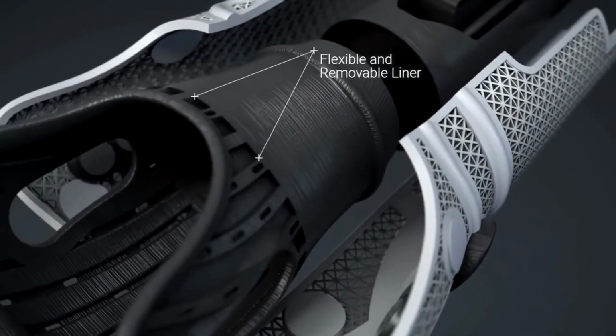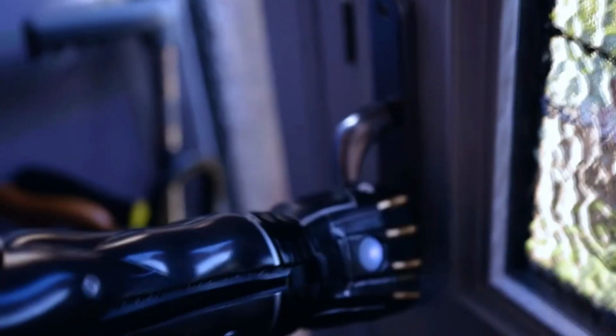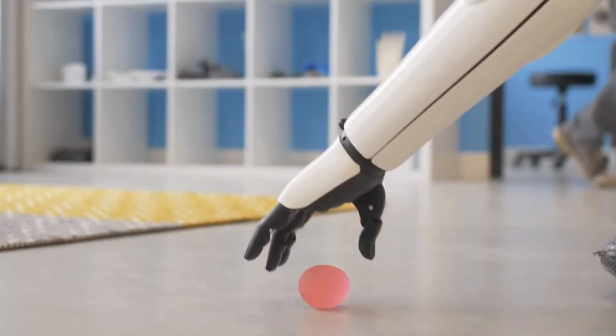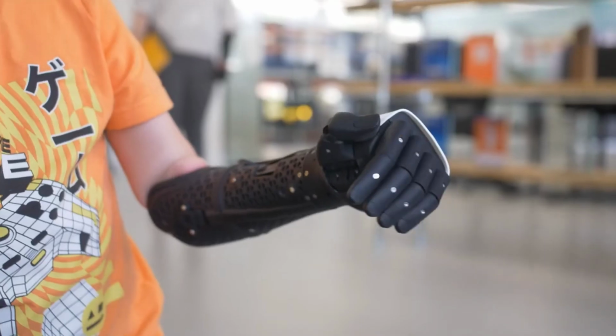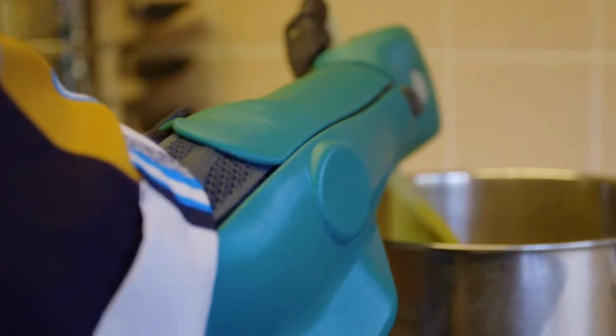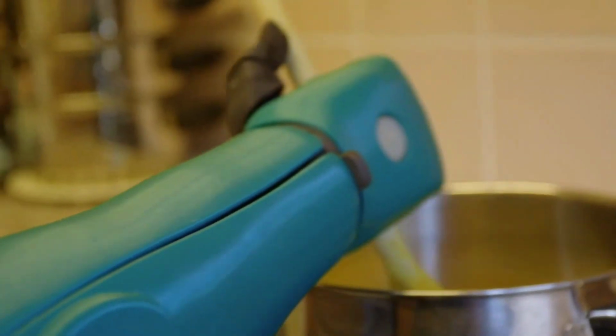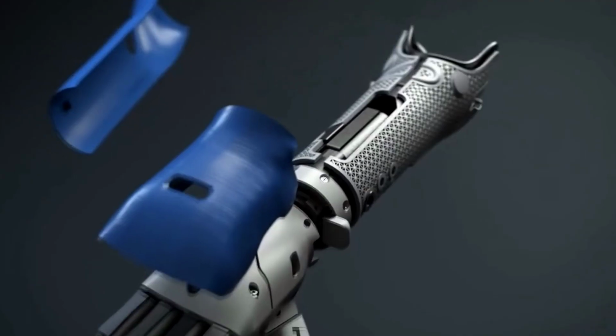With the use of this technology, amputees can now change clothes, open doors, type on a keyboard, eat, and even hold pencils all by themselves. However, using the technology is not recommended for dangerous circumstances or any severe activity because there is a possibility that it will malfunction or the battery will run out.